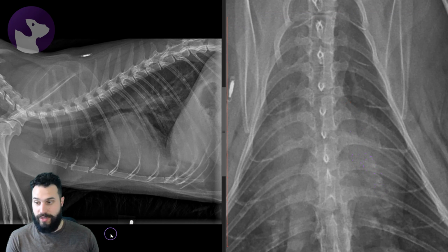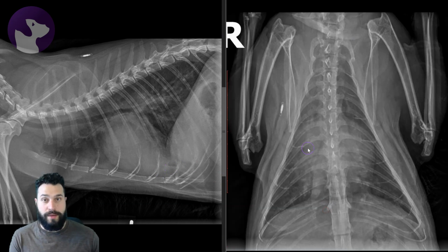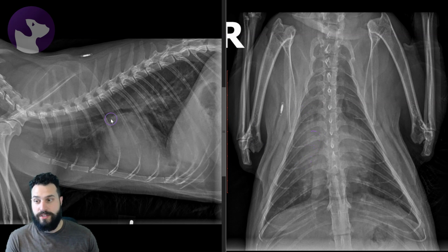So this is a pulmonary artery here. I'm going to highlight that for you. Pulmonary vein. Similarly, coming out here, an artery. And the vein's a little bit challenging because we've got our vena cava lying over top of this region here. This is our vena cava. But our vasculature is also enlarged. When it comes time to causes of this pulmonary pattern, we need to be prioritizing a cardiogenic cause because of the cardiovascular changes in this patient.